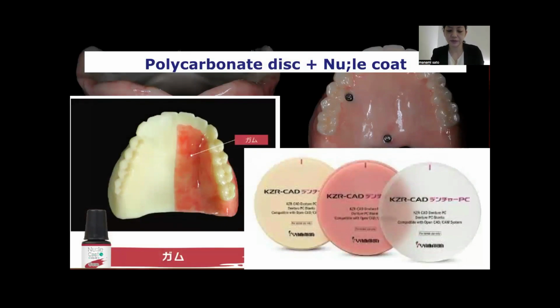We also manufactured colored dentures by carving out of polycarbonate discs like this one.